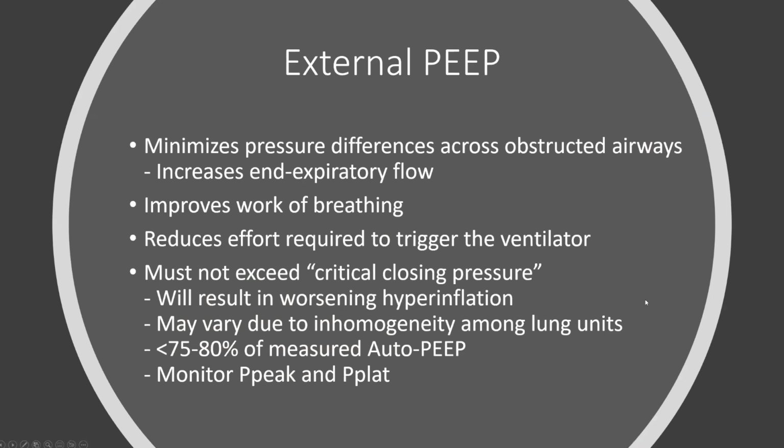Lastly, talking about external PEEP, it minimizes the pressure difference across the obstructed airways, keeping the airways open, allowing airflow to progress naturally and allowing the lungs to reach their natural state of relaxation, thereby improving the work of breathing and the effort required to trigger the ventilator. But as mentioned before, you cannot exceed the height of the waterfall, otherwise you will worsen hyperinflation.